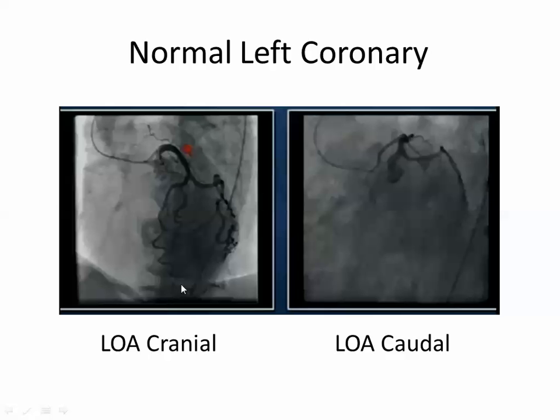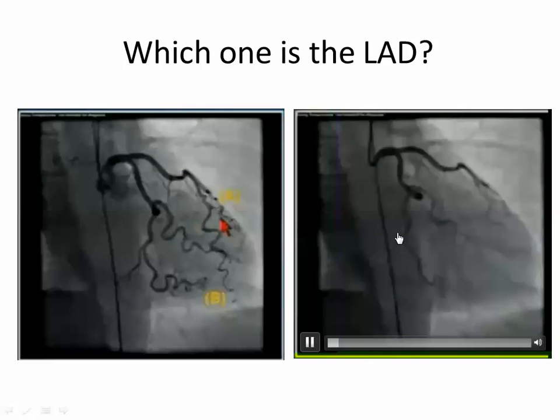This is LAO, because this is the shaft, and this is the shaft. Here is the diaphragm, so it's cranial. Septum, anterior, lateral, inferior. So what is this? LAD is this, lateral is LCX. Not dominant because no inferior. What's this? The shaft is here, spine is here, aorta is here, so it is LAO. So what is septum, anterior, lateral, inferior? The septum, LAD; lateral, LCX; no inferior, so it is not dominant.